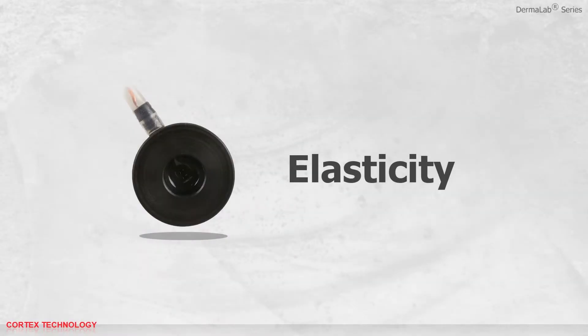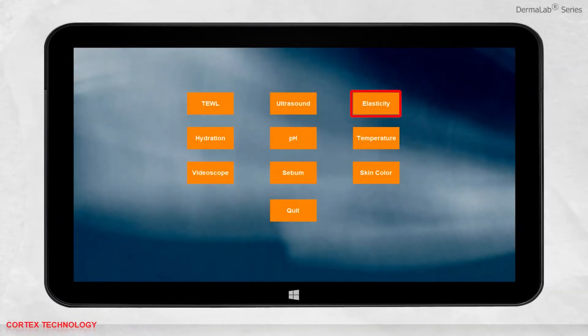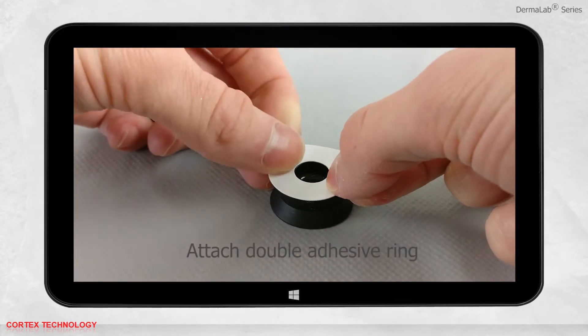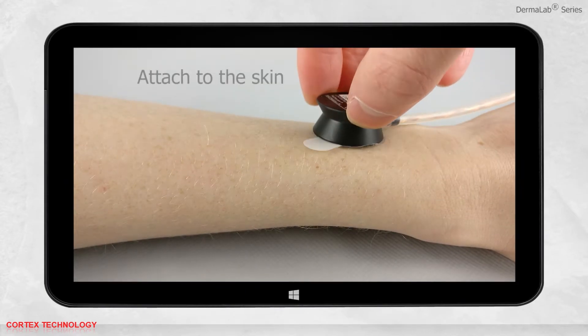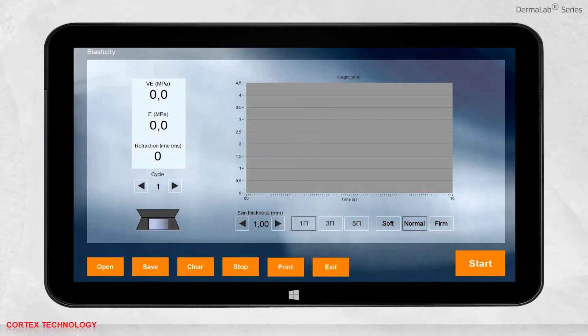Elasticity application. Select elasticity. Before starting a measurement, you may select the skin thickness, the number of measurement cycles, and the skin properties. Afterwards, you need to prepare the probe: attach the double adhesive ring to the probe, which is used to prevent creeping and folding of the skin. Attach the probe to the skin and press start. The results will be shown in the interface.